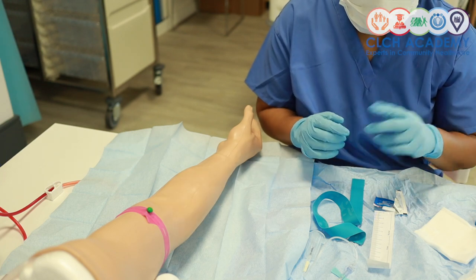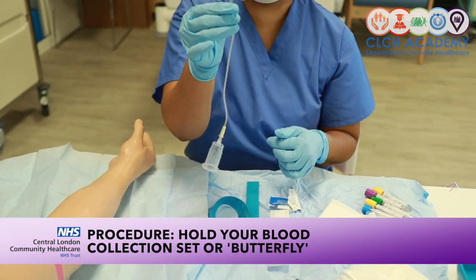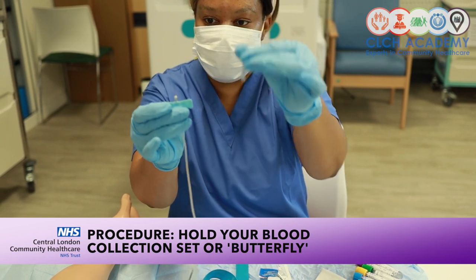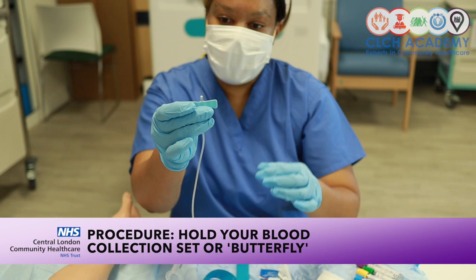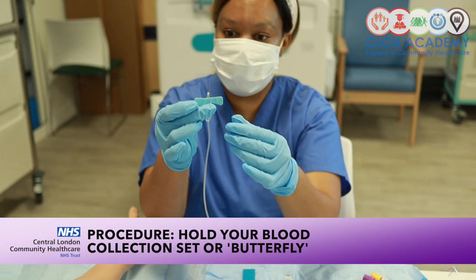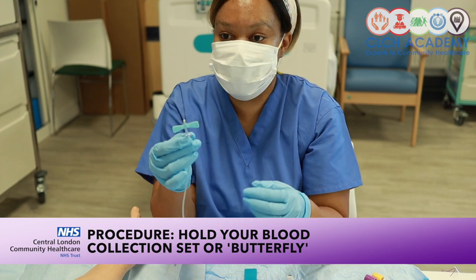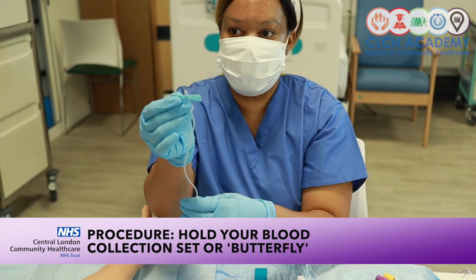The next thing I'm going to think about is grabbing my device. I'll start off with the blood safety collection set. Lovely short little needle. And for most patients, this is probably one of the most acceptable devices available for collecting bloods, as it is a butterfly and the needle is quite short. So for someone who's needle phobic, this would be a preferable needle to use.